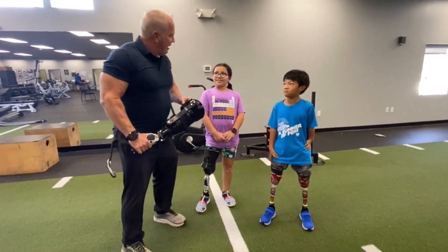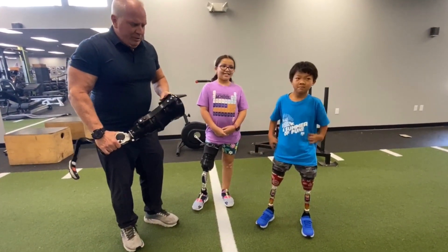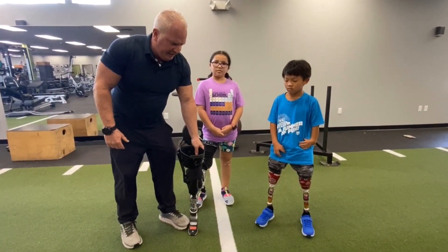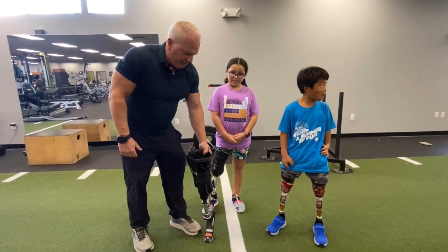We have Charlie and Azalea here — say hi to Karen. What we're doing is showing them both in the PPS system. This is actually Azalea's running leg and we're going to show you how she runs and how well she does in just a second.